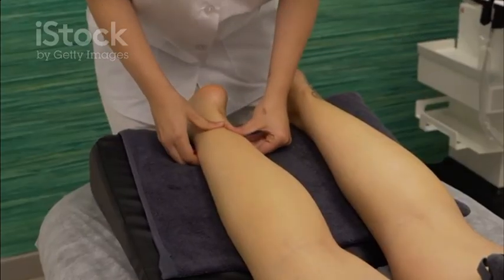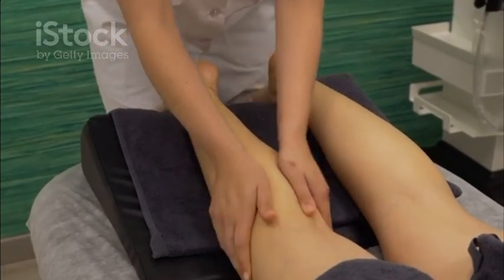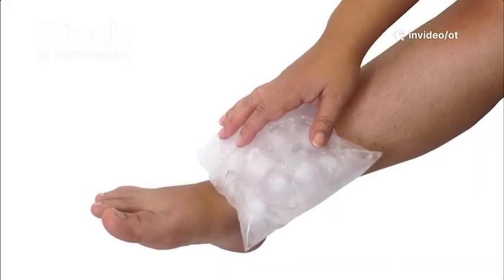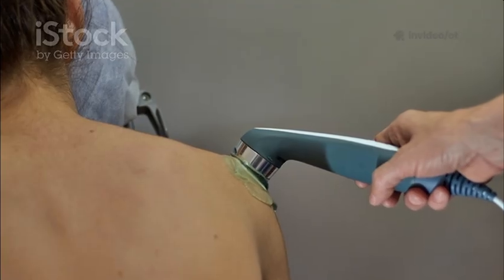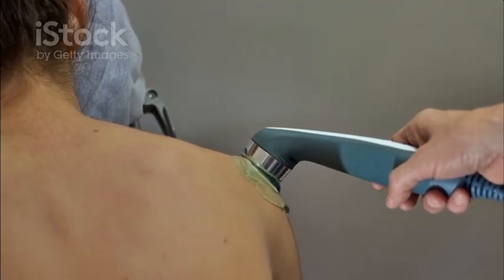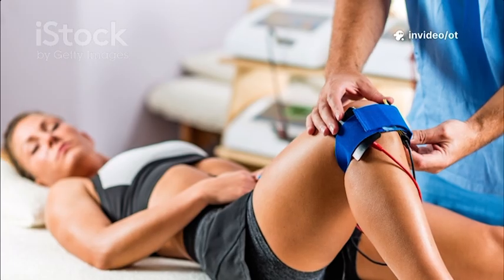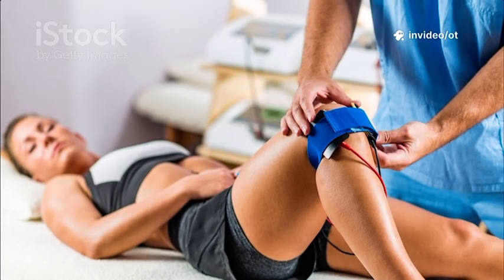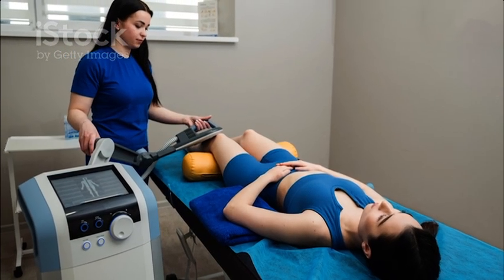Cryotherapy, the therapeutic application of cold, functions as the physiological counterpart to heat. Vasoconstriction, narrowing of blood vessels, is the primary mechanism. By slowing local blood flow, cold helps control swelling and bleeding after trauma. Lower tissue temperature decreases metabolic rate, reduces inflammatory mediators, and limits secondary tissue damage. Cold produces analgesia by slowing nerve conduction, numbing the area, and relieving pain. It's the modality of choice in the initial injury phase.